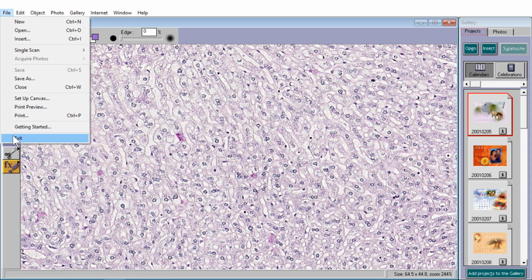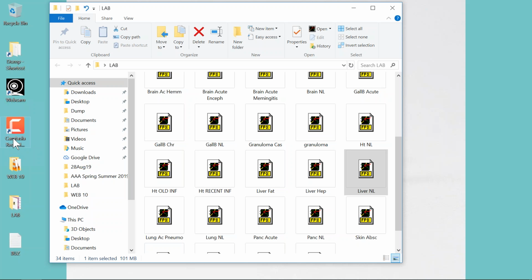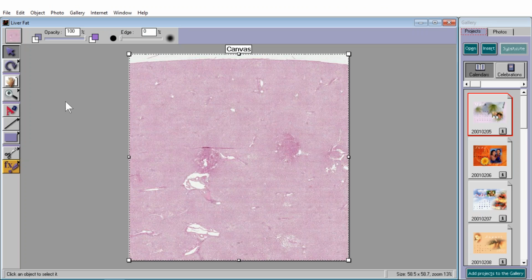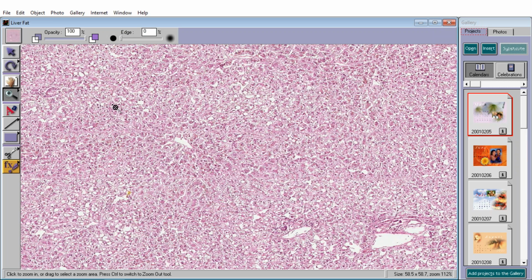We talked about one of the most common types of liver diseases found in alcoholics, in diabetics, and in fat people. Okay, this is called a fatty liver, and I think you'll recognize it instantly as fat, because now you don't really see those nice cords.